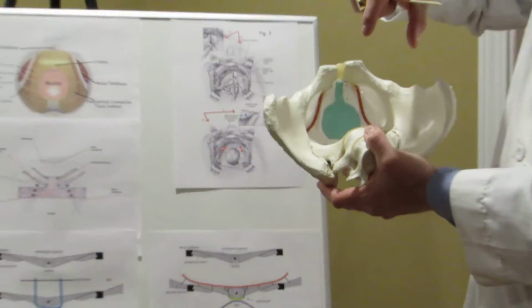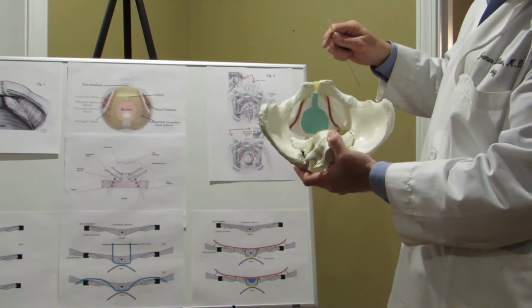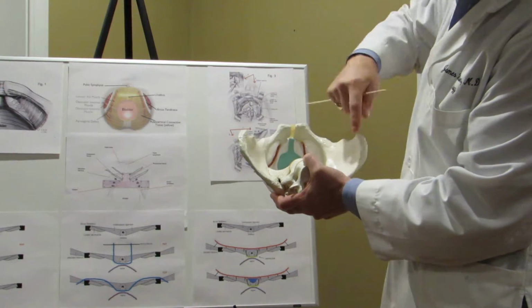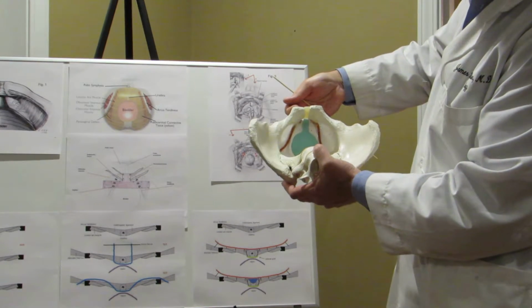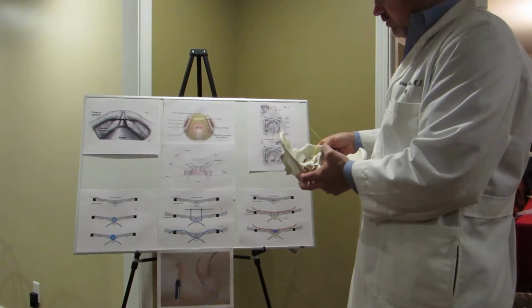This was not an artificial sling. This was either harvested from the patient or it was donor fascia. And this was very popular in the late 90s. That would also go around here and you would tighten it up to the rectus fascia and hold up this area. That's a pubovaginal sling. And later we saw the mid-urethral sling made with polypropylene mesh.